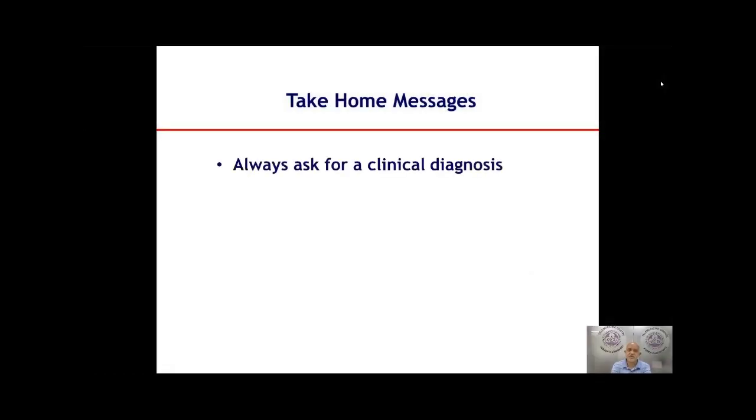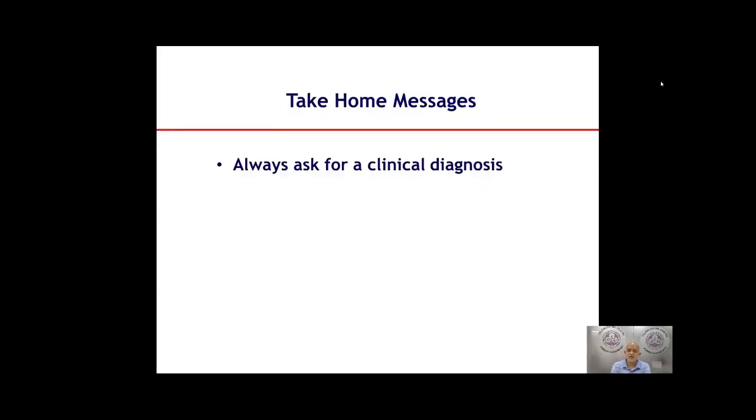To summarize, always ask for the clinical diagnosis before you read an ECG and X-ray, which will be extremely useful in making the diagnosis. Thank you for the opportunity. I hope the X-ray session was useful today. Thank you.